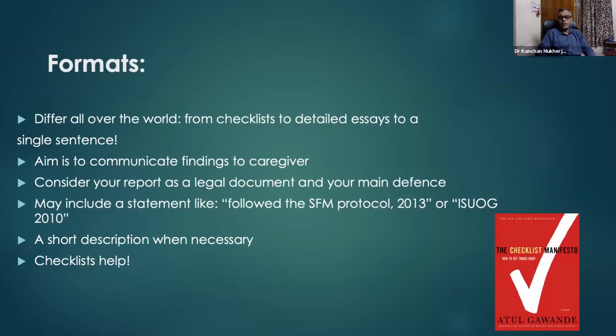Now, our society, the Society of Fetal Medicine, in its anatomy scan guideline says you may include a statement like followed SFM protocol 2013, that is when the guideline came out, or the International Society of Ultrasonography in Obs and Gynae guidelines in 2010. If you want to include a statement like that, that's fair enough. And whenever necessary, use a short description of the findings.